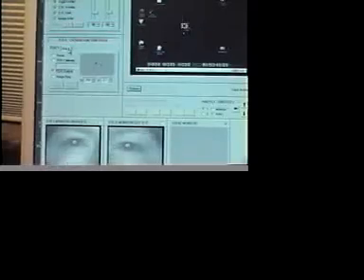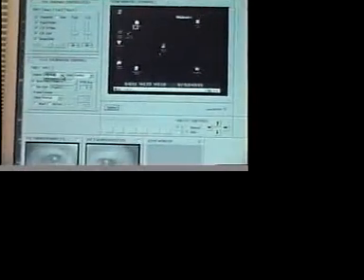Now I've calibrated them in a mode where we've got A, B average. That's the average of both eyes. I go into A plus B. We'll see a cursor showing up that corresponds to his left and right eye. So Pat, close one of your eyes. You see only one cursor shows up, then both show up.